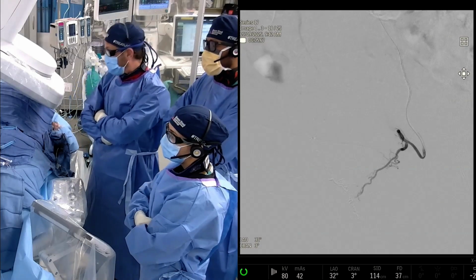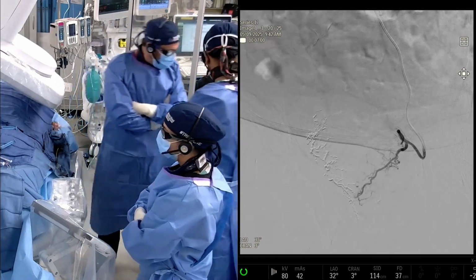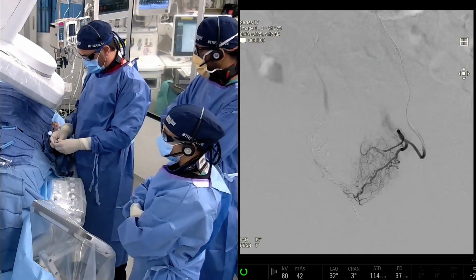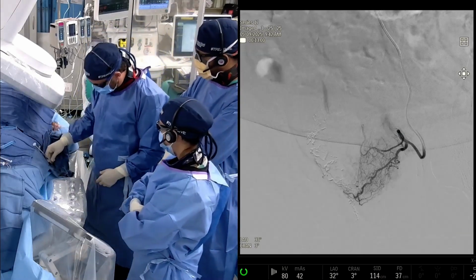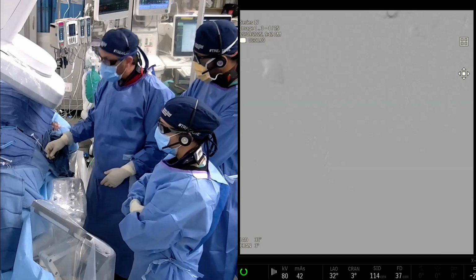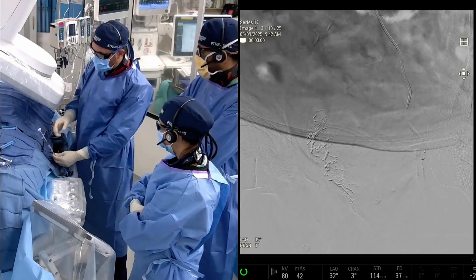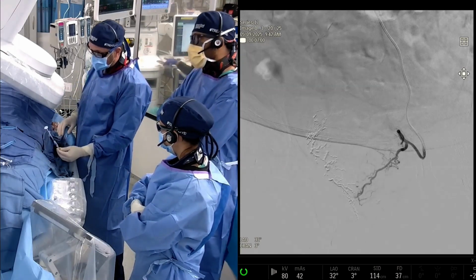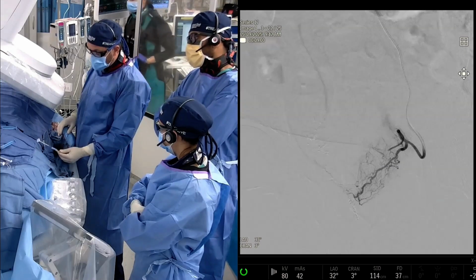What do you guys think about that? Let's put the balloon up. I'm a big fan of looking at how the nitro flows out of the end of the catheter. So whatever's left in my catheter before the nitro, the contrast that I flush through, I try to look at where the distribution's going and adjust my pressure. I think that's really key to understand the whole process here.